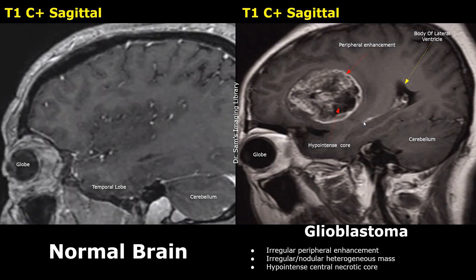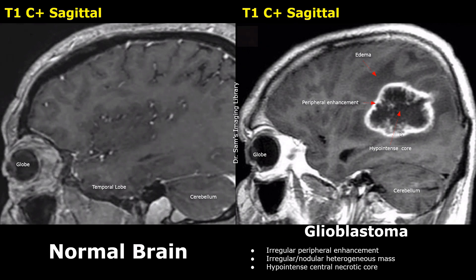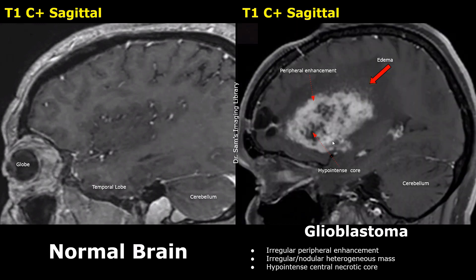Now we will look at some sagittal images of the brain. In this image, the mass is mostly heterogeneous but we can still notice peripheral enhancement and a hypo-intense central core. Here is another sagittal image showing a glioblastoma in a contrast-enhanced T1 image with strong peripheral enhancement and a dark central core. Edema is also noted around the mass, appearing as dark gray areas. Some glioblastomas can have a predominantly enhancing appearance in a T1 contrast-enhanced image with a small hypo-intense central core. Irregular contours indicate that it is an infiltrating aggressive lesion. Edema is also present.